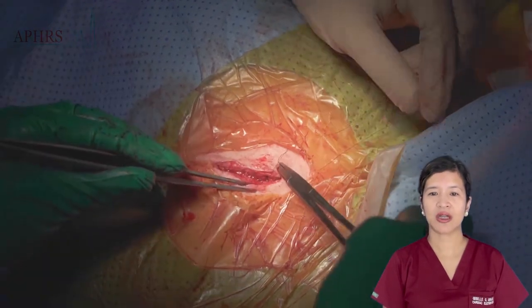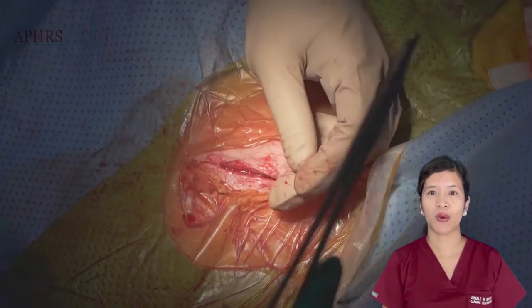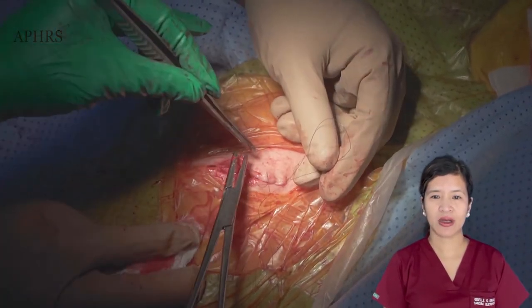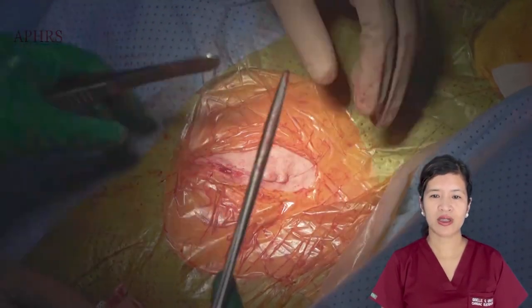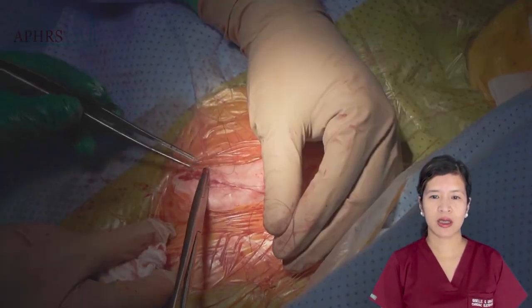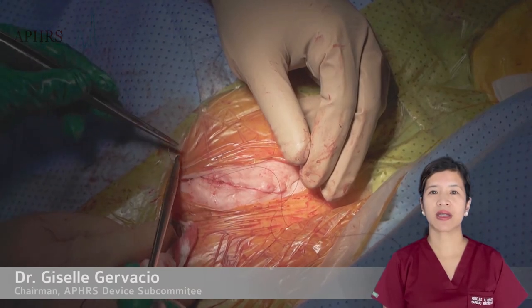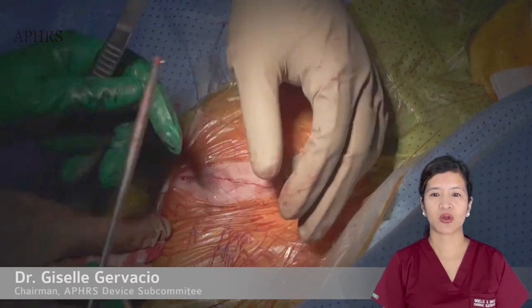The final layer is a subcuticular layer, which I close using a monofilament 4-0 such as Monosyn or Monocryl. In the video you can see the subcuticular layer is being applied without a knot and with the least tension possible to create an aesthetically pleasing result. When we get to the end of the subcuticular layer we do not knot — instead we pull the suture through at the end and cut the remaining suture.